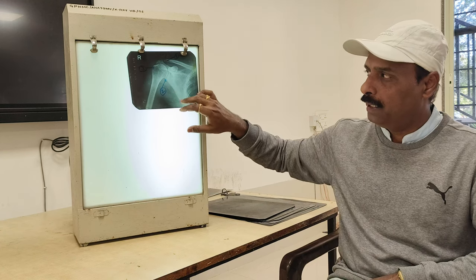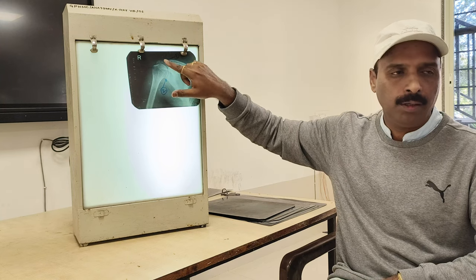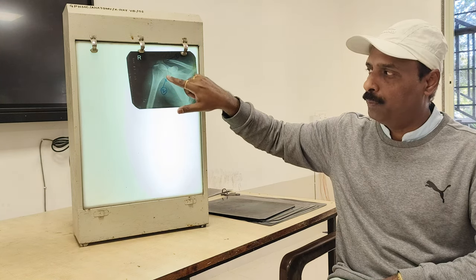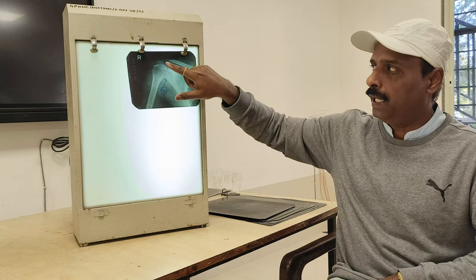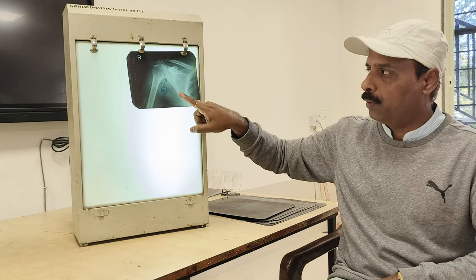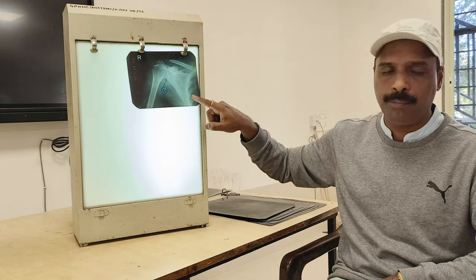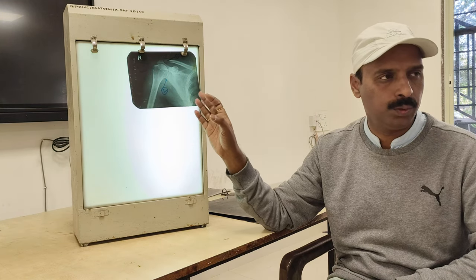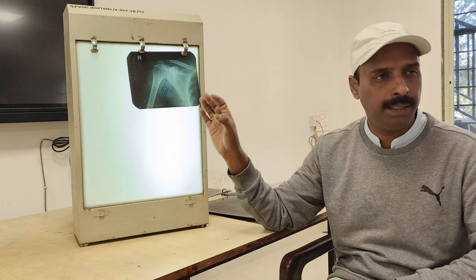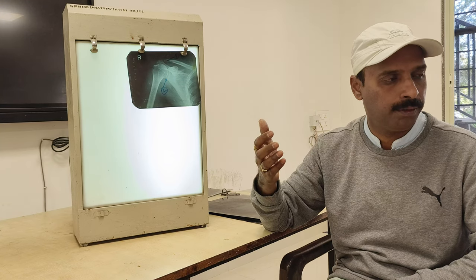The X-ray shown here is the right shoulder joint, in which we have the glenoid cavity of the scapula and the head of the humerus. We have the upper half of the shaft of the humerus. Then we have the clavicle, then the acromioclavicular joint. Then we have the lateral and medial borders of the scapula. Then we have the rib cage. So what is the comment on this X-ray? You have to comment that this is a plain X-ray. You have to tell the type of X-ray first, then proceed to the comment.